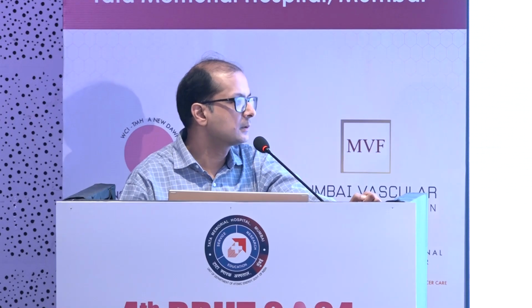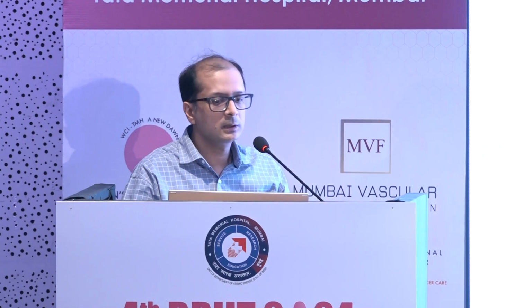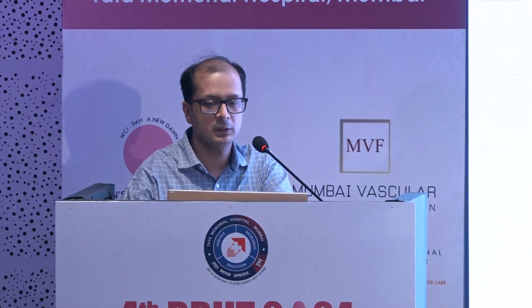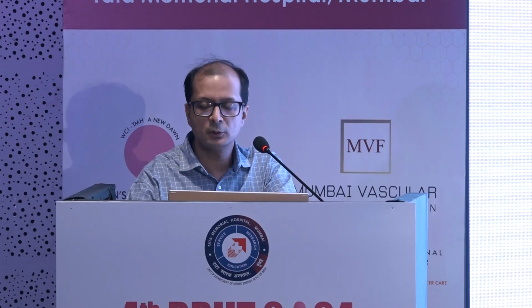Post procedure is pretty much the same as other biopsies. Okay. I think that's it. So this is what we have covered. Whenever it is a tough fibrous lesion, VAB can be a little challenging. We can do hydrodissection. If the lesion is located anteriorly, you need to have a good hydrodissection anteriorly, or if it is located posteriorly along the pectoralis, then you need to lift the lesion anteriorly so that you go beneath the lesion.